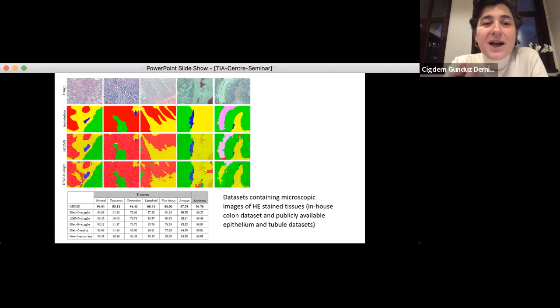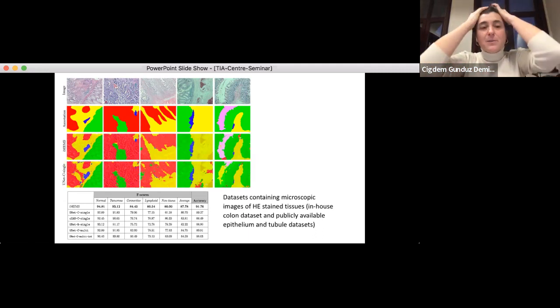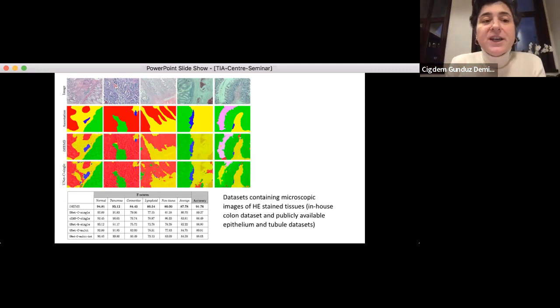But if you have some heterogeneity, for example because of the noise and artifacts, maybe it can lower your results. So it totally depends on what kind of segmentation problem you're dealing with. Okay, great.